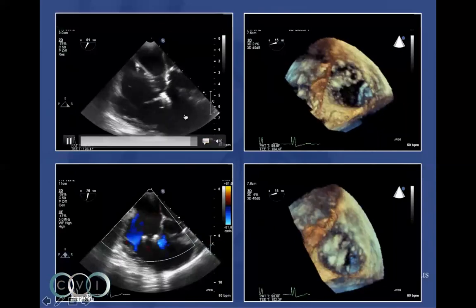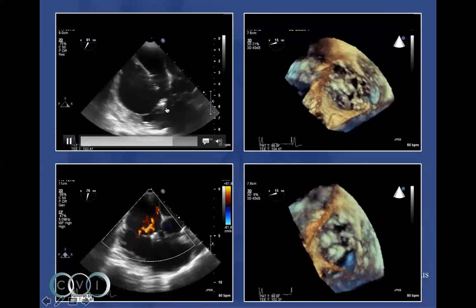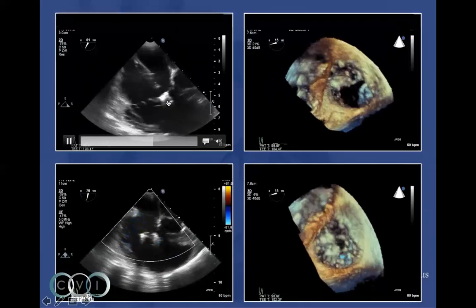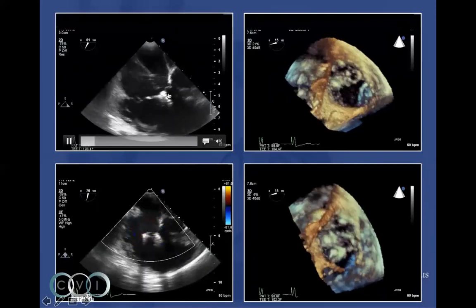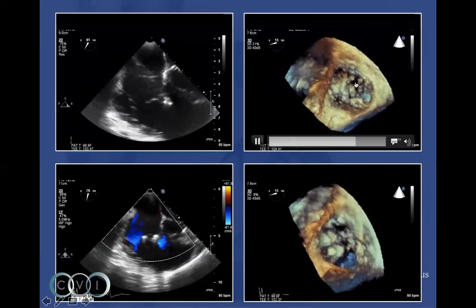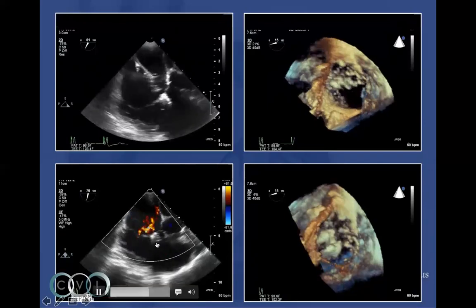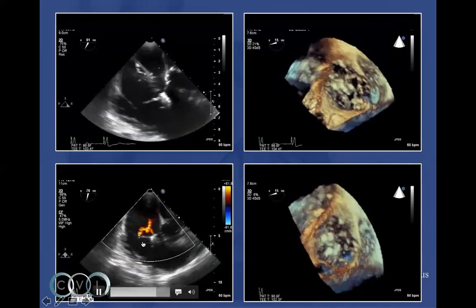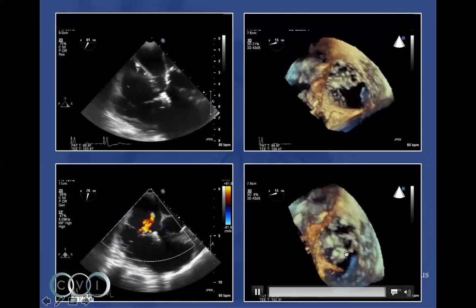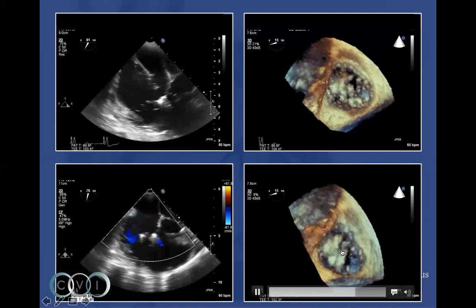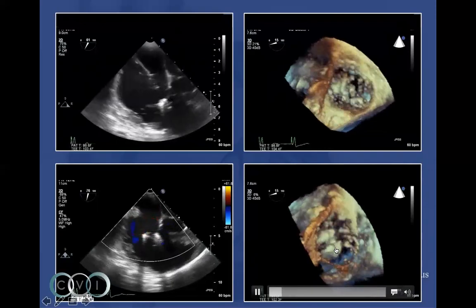Here is the MitraClip used off-label in the tricuspid position. You can see nice, excellent leaflet insertion. This is the first clip placed on the anteroseptal area, and then we place a second clip — the TR is much improved. This is a nice 3D view from the right atrium showing the two clips in place in essentially the anteroseptal commissure of the tricuspid valve.